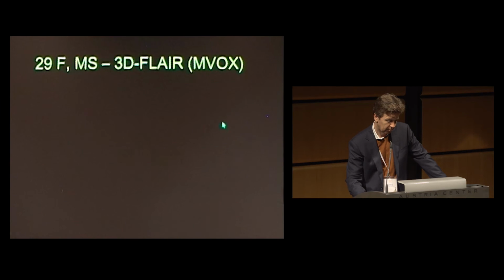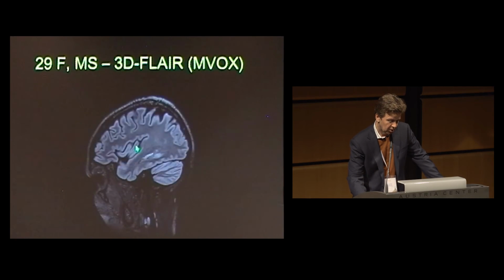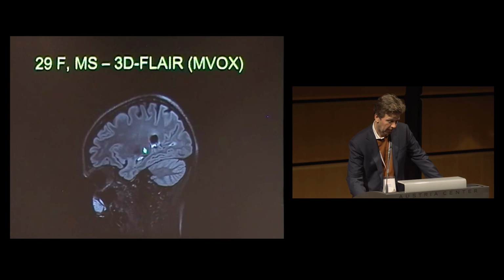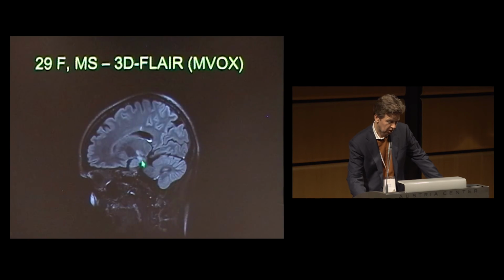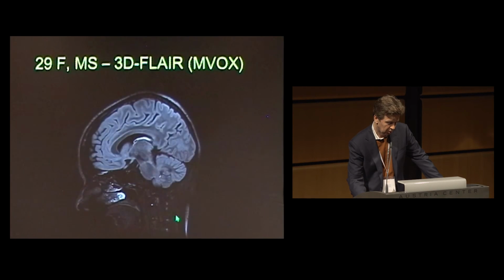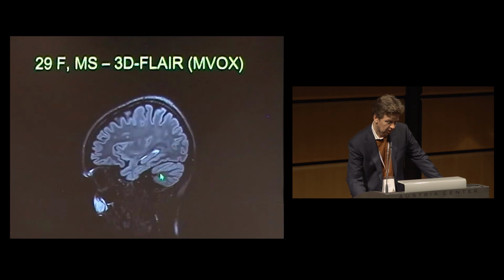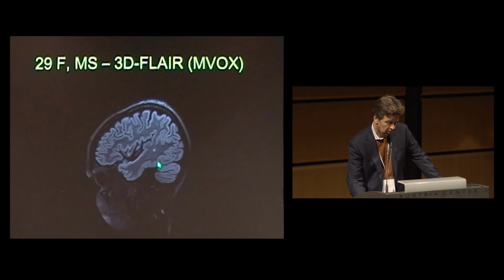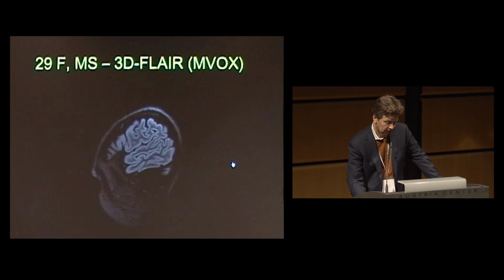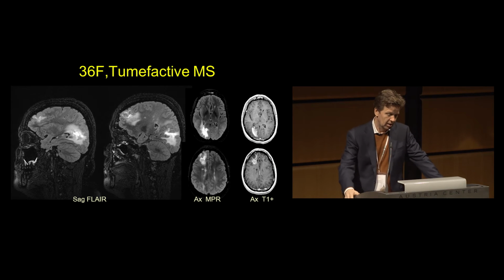Let's play this once again. Hopefully succeed. So the symptomatic lesion is in the internal capsule here in a second. And you will notice the Wallerian degeneration going down in the spinal cord over here. And then multiple lesions in the cervical cord, multiple periventricular lesions, and a lesion in the cerebellum. And at the end, you will see a juxtacortical lesion appearing over here. So this very nicely shows you the details, and you can reformat it in any plane and review.